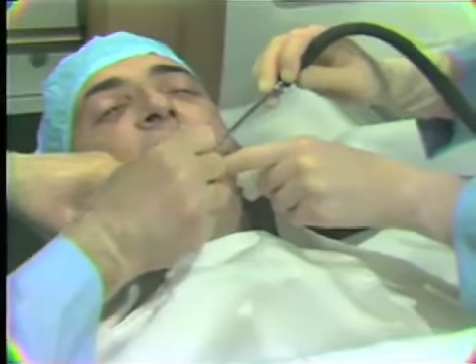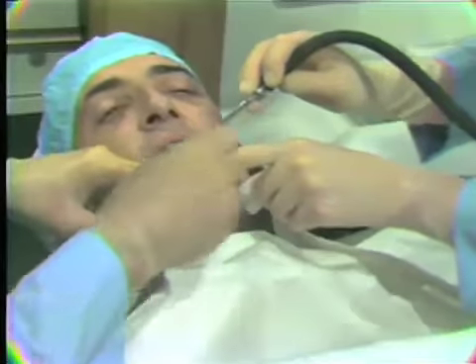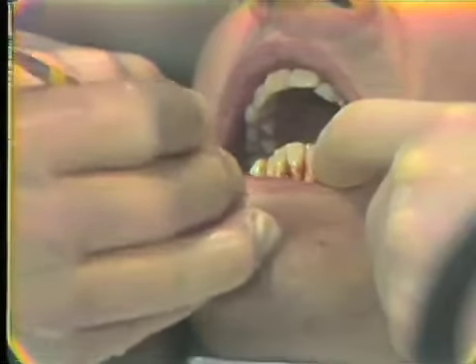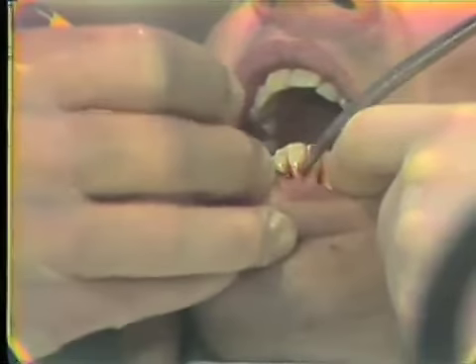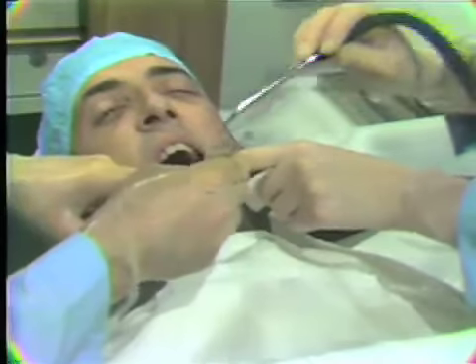She also can help by using fingers for retraction. There are times when we'll be using the instrument for retraction also, but constant movement of the aspirator throughout the area provides us the best access to the surgical site.